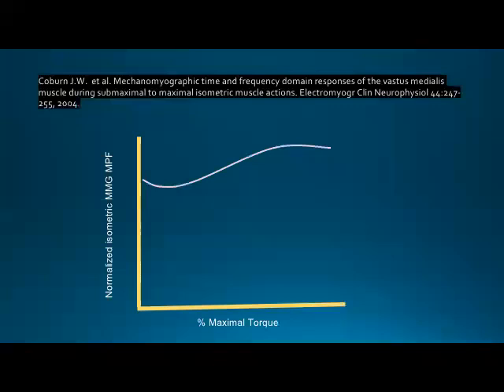What did frequency do? So here's our mean power frequency. So remember, MMG frequency is actually going to tell us the firing rate. So how frequently you're sending nervous impulses down that muscle fiber. So we see that it's kind of plateaued in a similar way at that low grade percent, right? So 10 to 40%, no real significant change in firing rate. If we look at about 40%, so we'll say this is about 40%. So between 40% and 75%, we see that MMG frequency goes up.